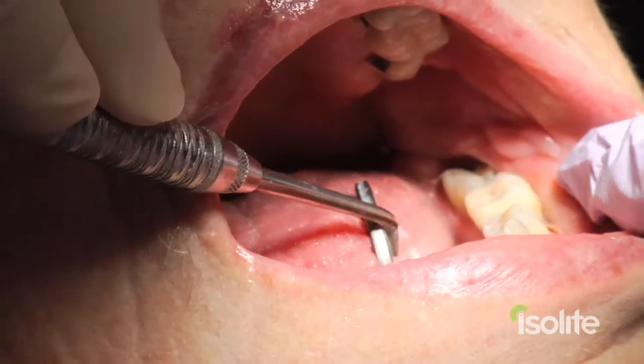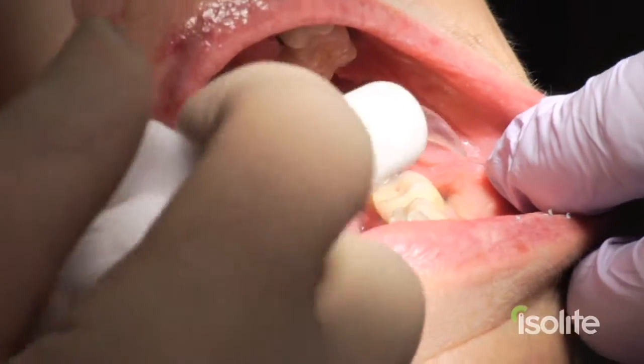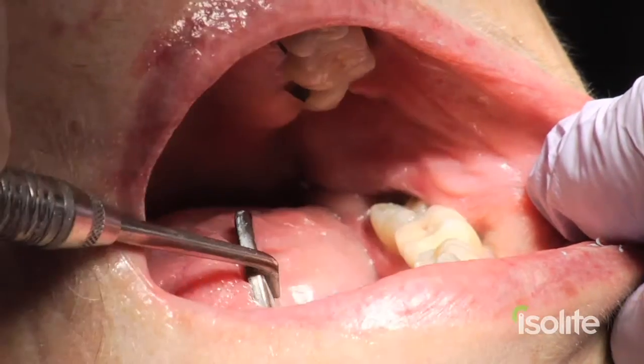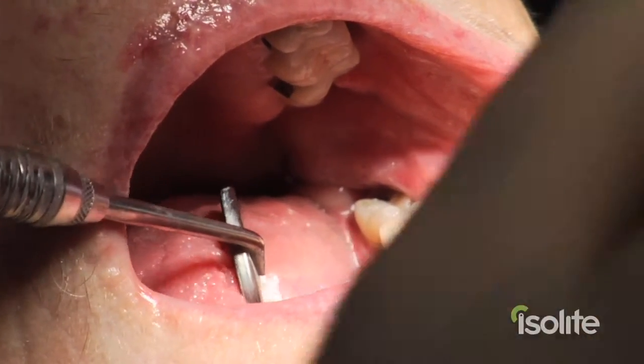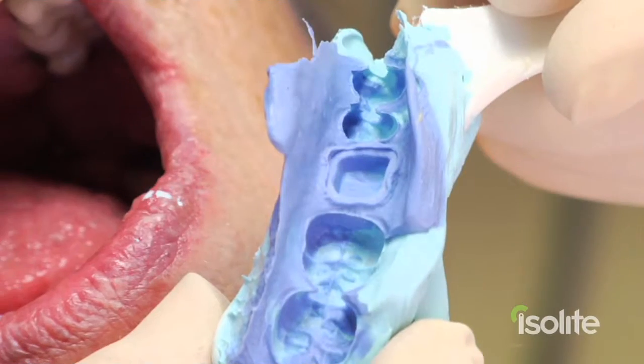I'm going to show you what it's like to take an impression without utilizing the Isolite — you all know what that's like. We've got the tongue out of the way, the cheek out of the way. We inject our impression material around the tooth and insert the triple tray. We hope the tongue doesn't get in the way, we hope the cheek doesn't get in the way, we hope it's all dry. Impressions with Isolite are just more predictable.